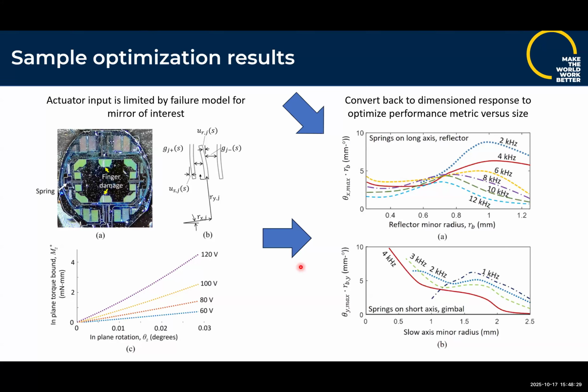So we have a constraint we already know we're trying to push. One is to simply push the tilt angle times the aperture size as far as possible. If we know that we have a certain aperture, certain field of view target, then we might optimize a secondary criteria, which, for example, in this case, was frequency. We knew we needed for a given application about a total of 5 mm aperture angle product, and about the highest frequency we could project to was maybe somewhere a little above 4 kilohertz, 5 kilohertz sort of range. And that's how we came down to a given design for this example.